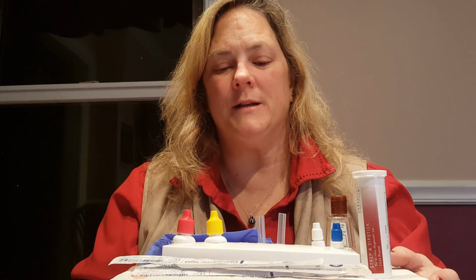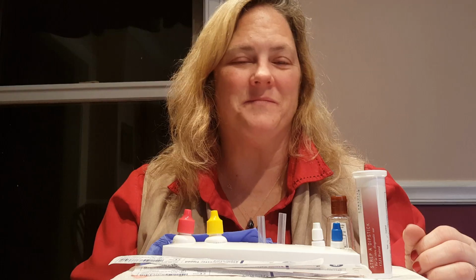Welcome to the strep testing competency video. Today we will walk through performing a strep test for quality control, as well as obtaining a sample on a patient and then running the test.